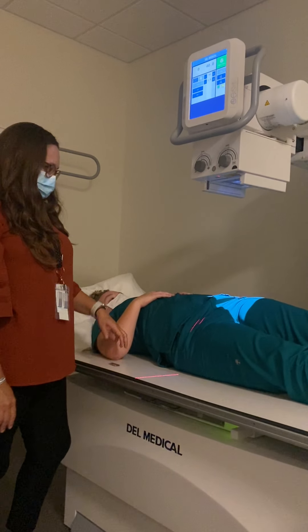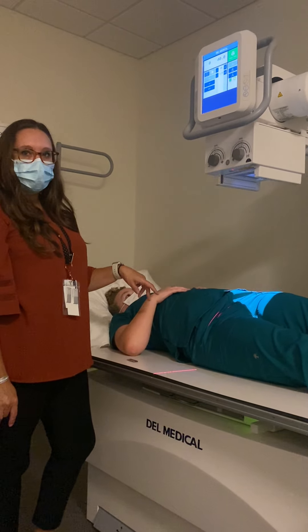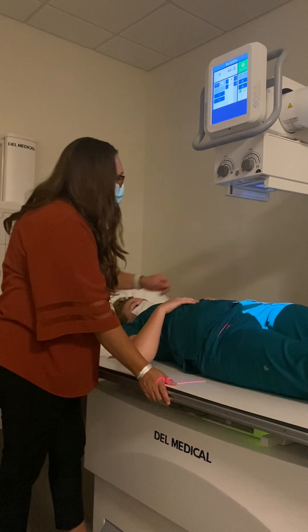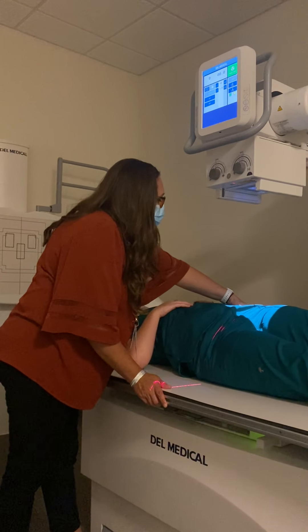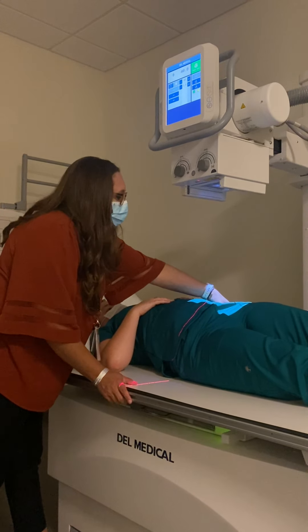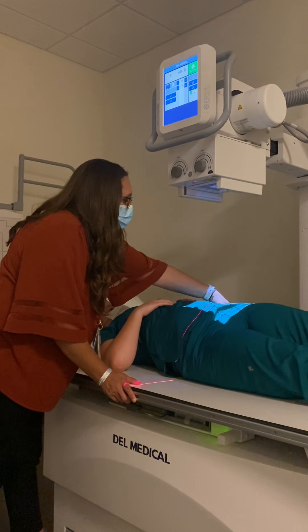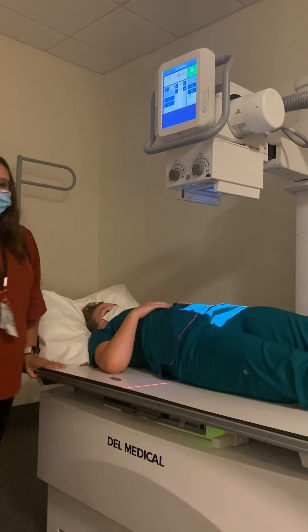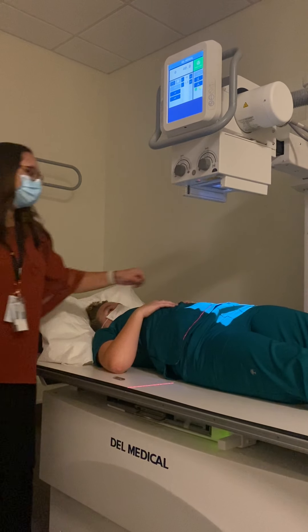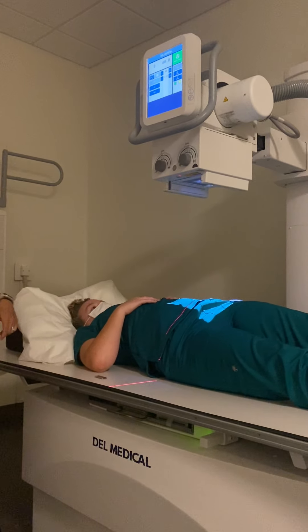For the obliques, we're going to do LPO and RPO, but we're always going to visualize the upside SI joint. I'm going to find the ASIS and center at the level of the ASIS, but one inch medial to the upside. We are visualizing her left SI joint for that, so I'm going to use my left marker.